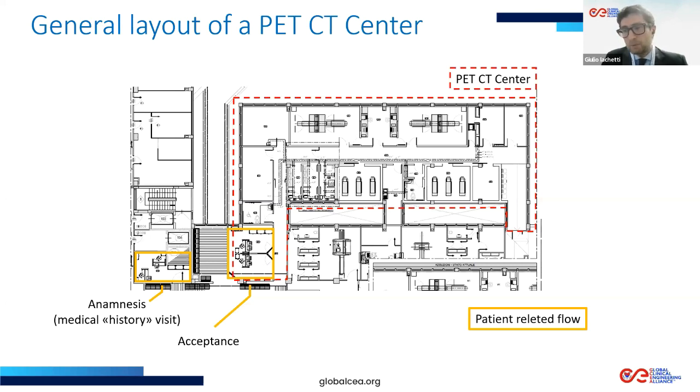The second example I would give you is about the justification principle. Nuclear medicine is always about, to permit to have images, the patient has to be exposed to radiation, and this can be dangerous for the patient. So this danger has to be justified, considering the benefits that the patient can have from a diagnosis.